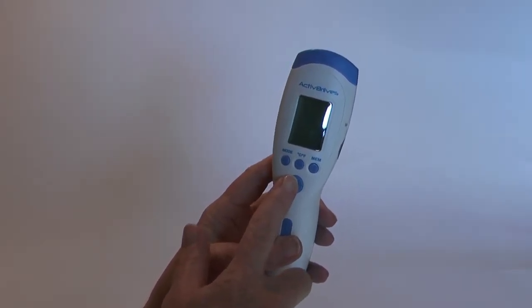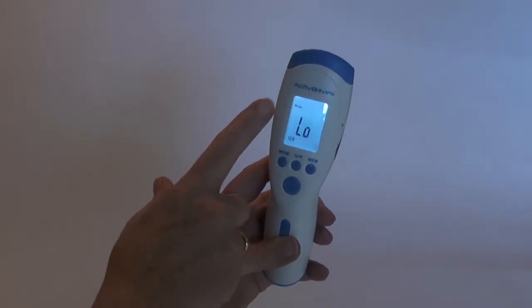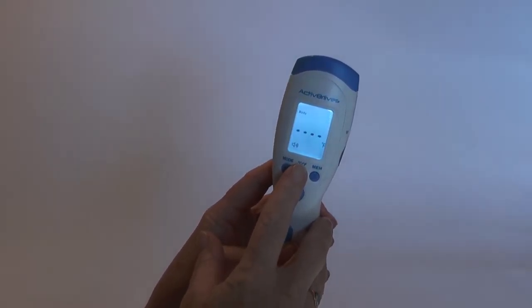Your contactless infrared thermometer uses infrared technology. You can change the measurement type from Celsius to Fahrenheit.